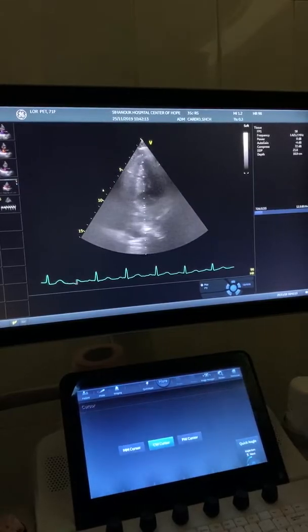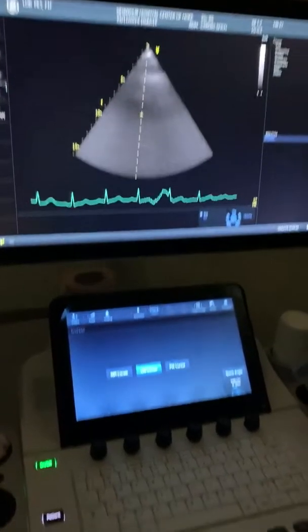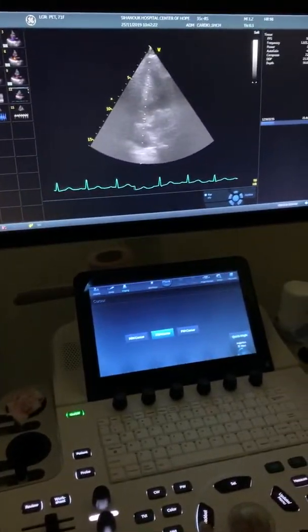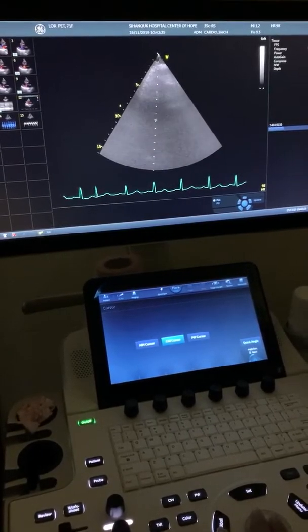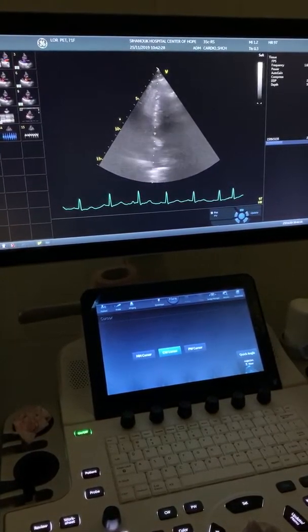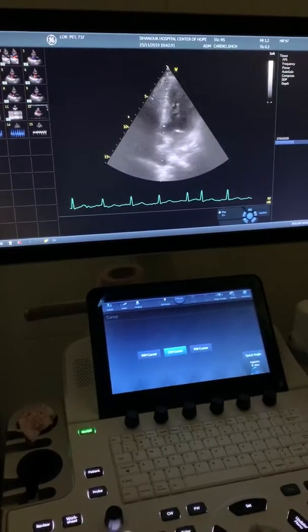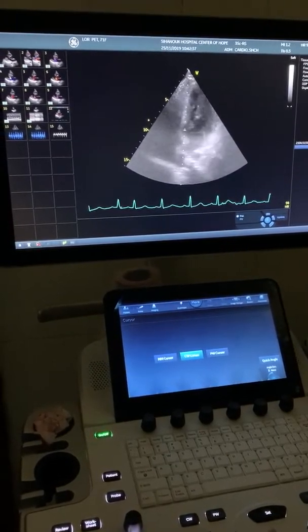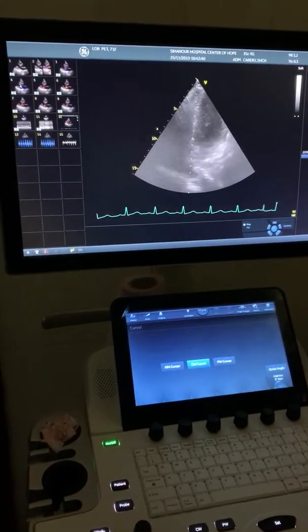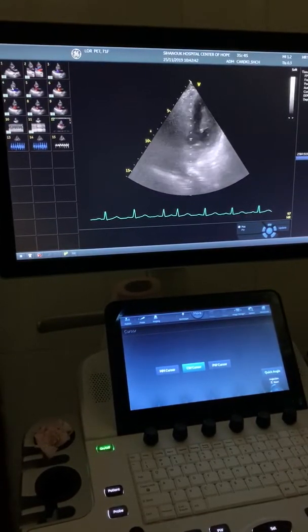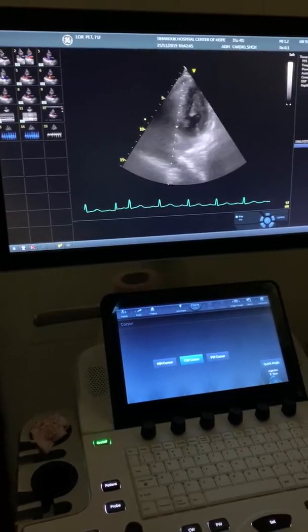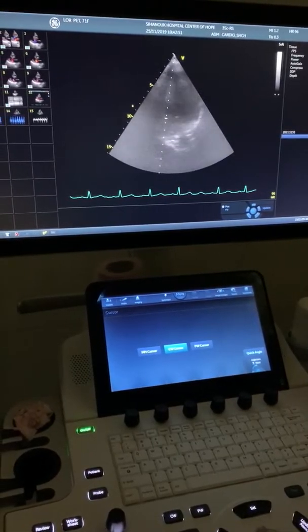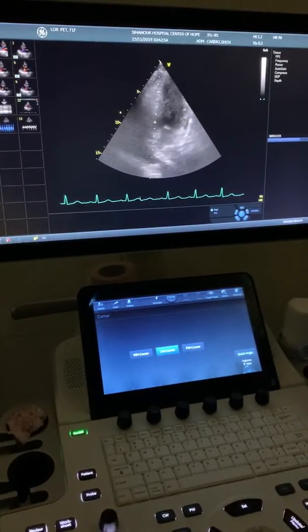Measure LVOT - always push the cursor, even though you don't know. It has to be in between - not inside, but in between. Yeah, in between the mitral and - this is between, doctor, because this is mitral right here, and this is your aortic valve here. Cannot be inside because you might get already a wrong value.